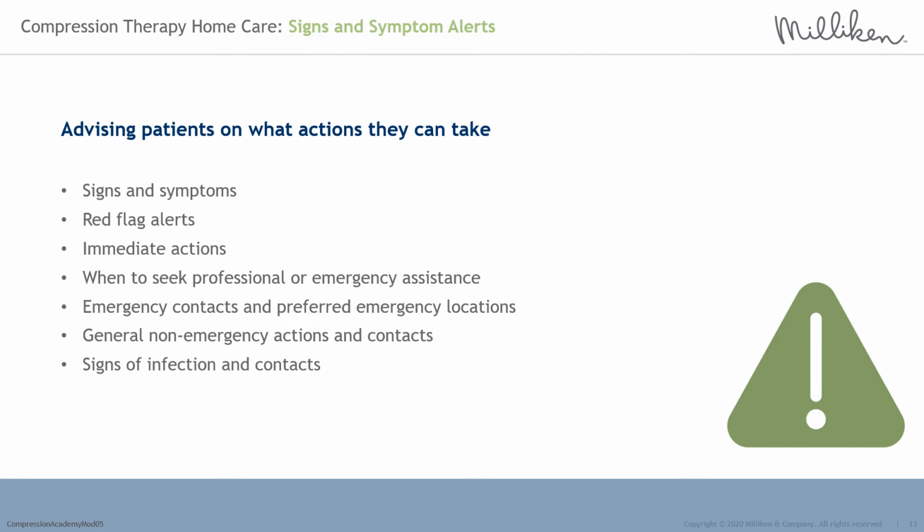Signs and symptom alerts, advising patients on what actions they can take. Inform your patient of the critically important signs and symptoms to look for when wearing compression therapy. Highlight red flag alerts. We will look at all of these more closely. Patients require advice on immediate action to be taken, such as compression removal.